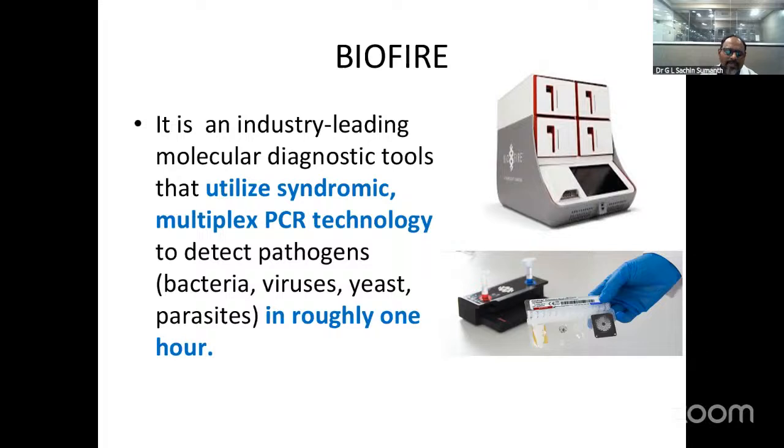Within 1 hour, especially for pneumonia cases and meningitis cases, we can detect whether it is a viral or bacterial pneumonia, or whether the meningitis is tubercular, viral, or bacterial, and what the pathogen inside that sample is. It is very helpful for the clinicians to give appropriate treatment, and it will really help for a better outcome for the patients.